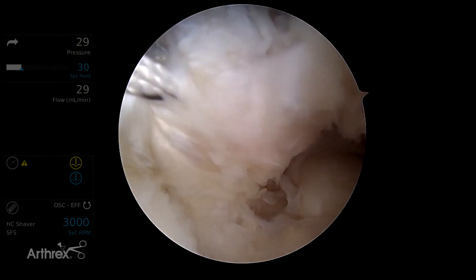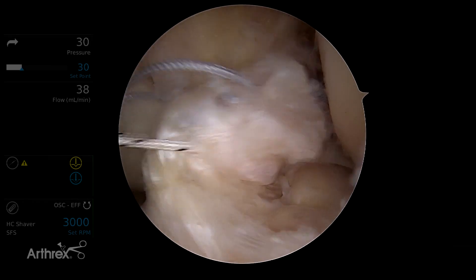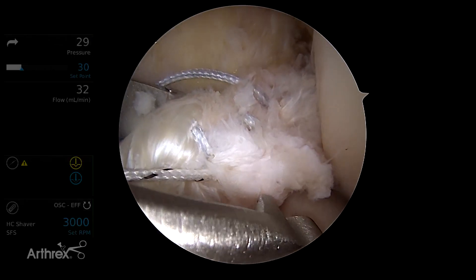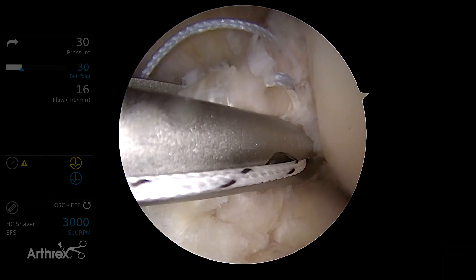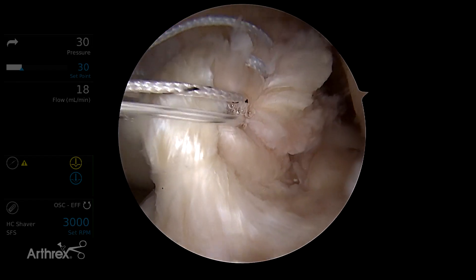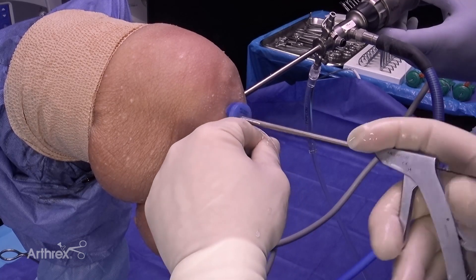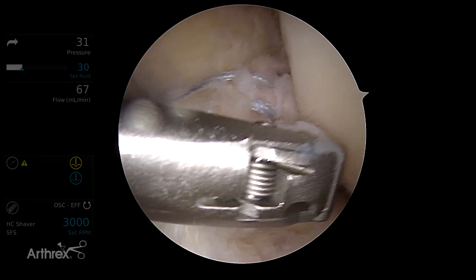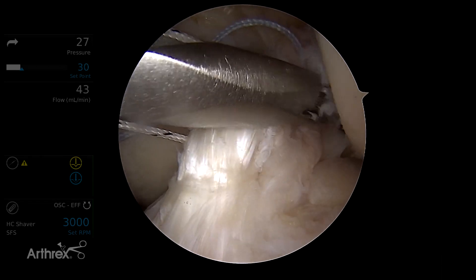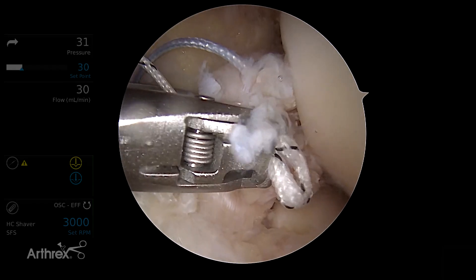As we get further up the ligament, we want to angle ourselves so we don't jam the scorpion needle right into the bone. We're going to bring the lateral limb of the tiger wire medially and then back laterally — that'll be the last bite. We'll go back medial, then bring both limbs back lateral and exit towards the wall. This is really just about as many bites as I take with most repairs. You can't do too many or else you start to clump up the ligament.